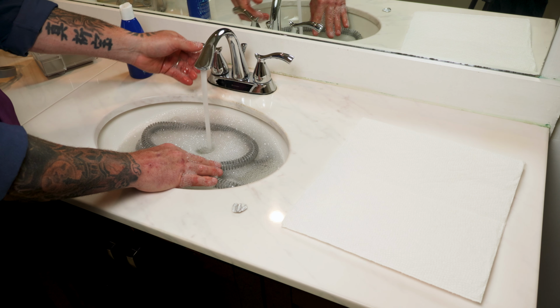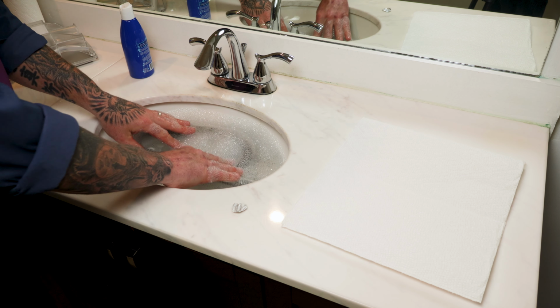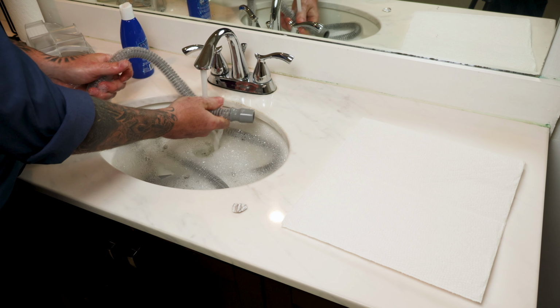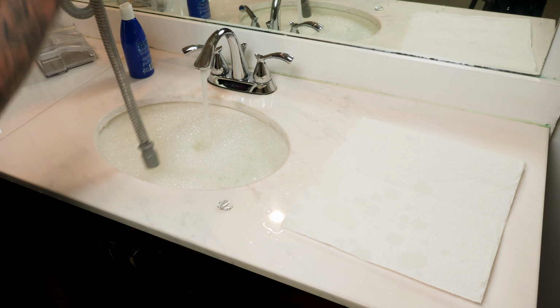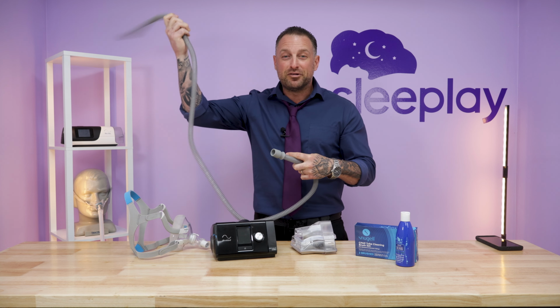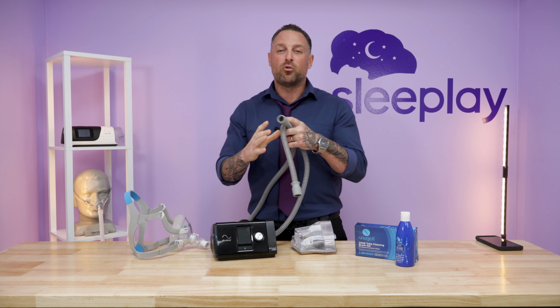The tubing, you can soak in the warm water, let it fill up inside, shake it around a little bit, and then afterwards you can run the water through the tube, and then you could throw it over a shower curtain rod, I always tell everybody, or a railing, okay? If you want to take the tubing outside and swing it around like Tarzan or like a cowboy, you're more than welcome to do so to get the water out thoroughly. Of course, you're not going to get all the water out, okay?